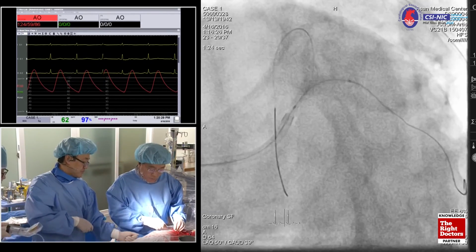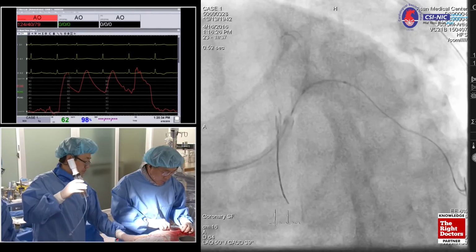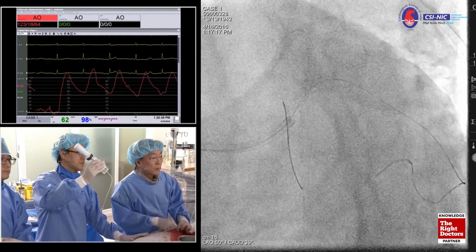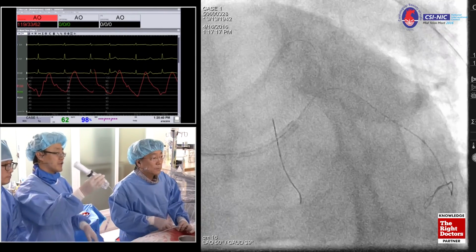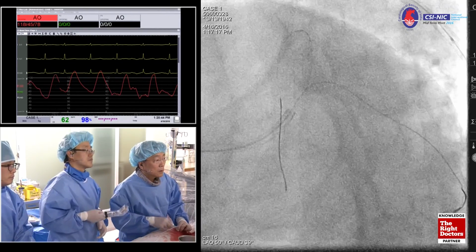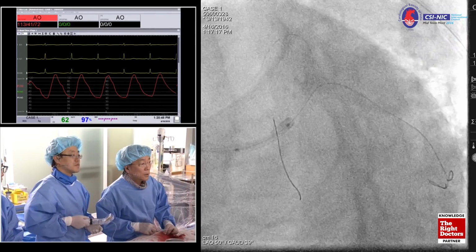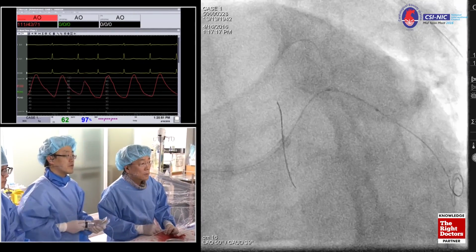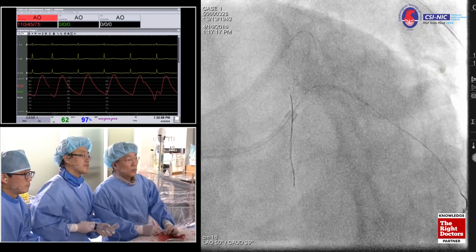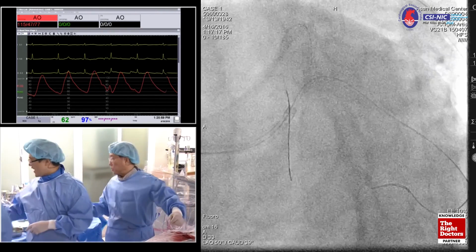Before we deploy the stent for the circumflex, we need a 3.5 balloon for the LAD. Okay, I think it's too deep. All right. This is 15, yes. Okay, good. Not too difficult to pass the stent. We need another balloon, the 3.5, just non-compliant, previously used non-compliant, yes.